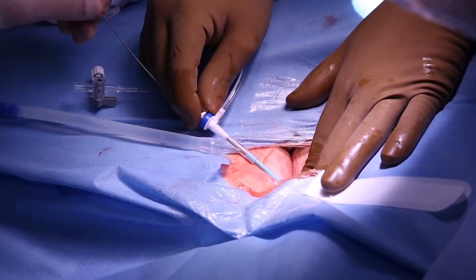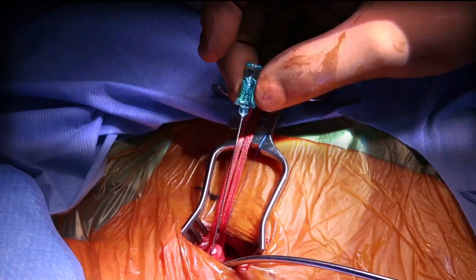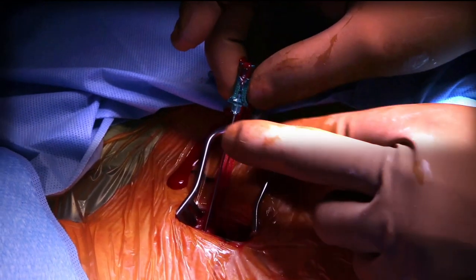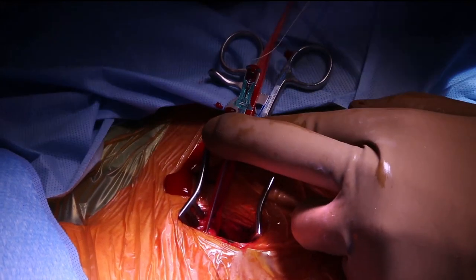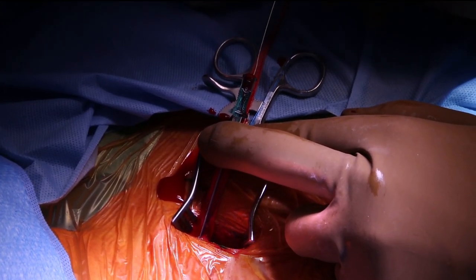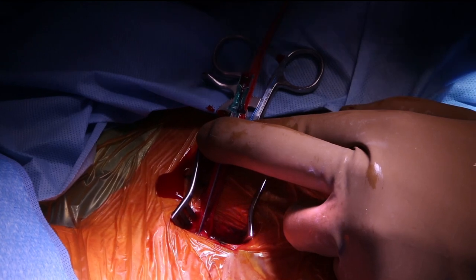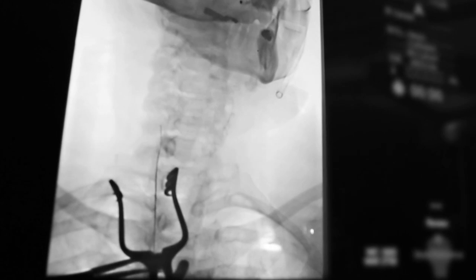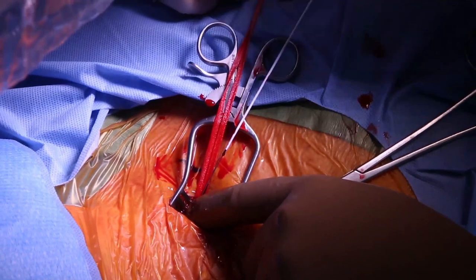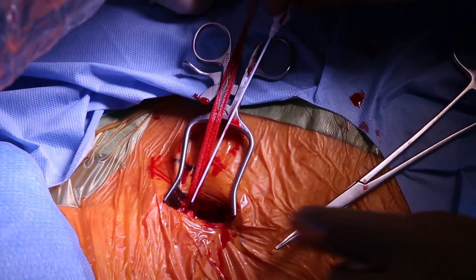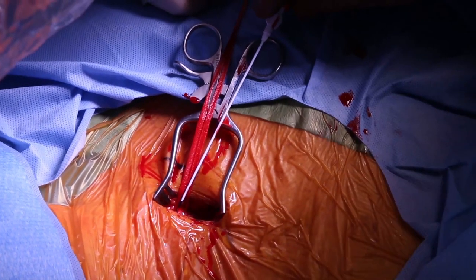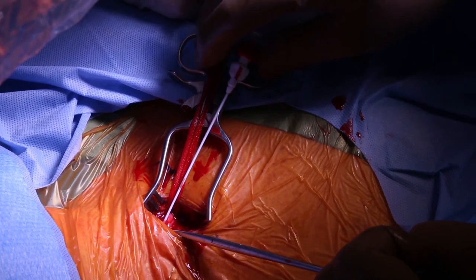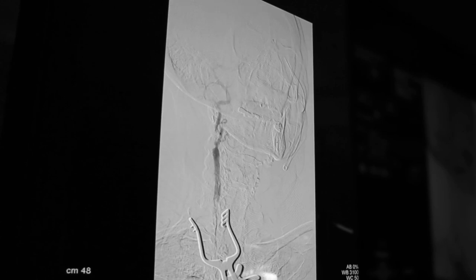A 9 French venous return sheath was introduced over an 0.035-inch wire into the common femoral vein. Micropuncture access was then gained in the common carotid artery after systemic heparinization with 7,000 units of intravenous heparin to maintain an ACT of 250. The micropuncture sheath was introduced into the common carotid artery, and hand injection of contrast confirmed good position and the location of the critical internal carotid artery stenosis.